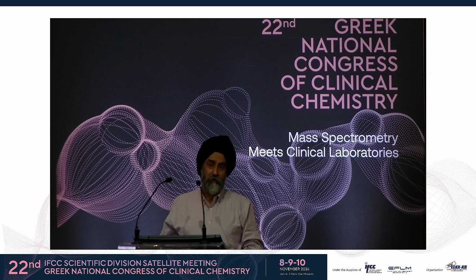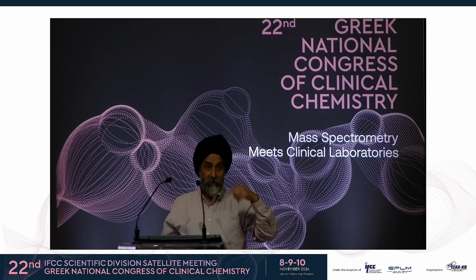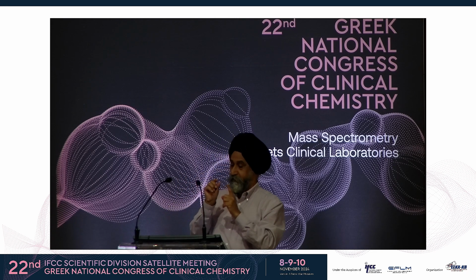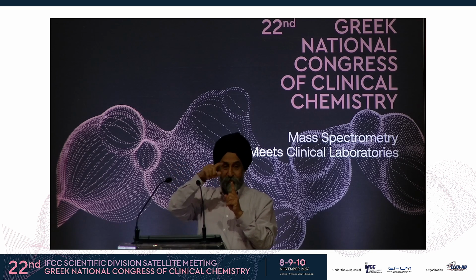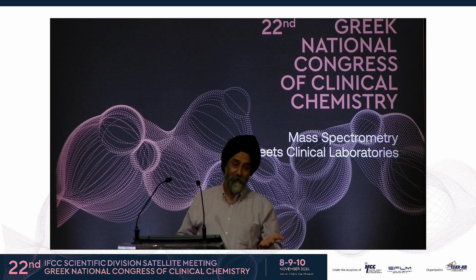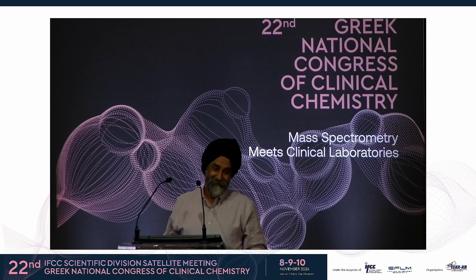Right. But we do have one investigator, she is looking for cyclic Cushing's. So now she is taking hair as a specimen, because some patients have Cushing's but they don't show the symptoms, or it's a cyclic Cushing's. So now she collects the hair, and then she monitors the 1st centimeter, 2nd centimeter, 3rd centimeter to confirm whether this patient has that. So we are just fixing the problems with the immunoassay at the moment. We have not gone deep, but maybe you will do that. Yeah, thank you.